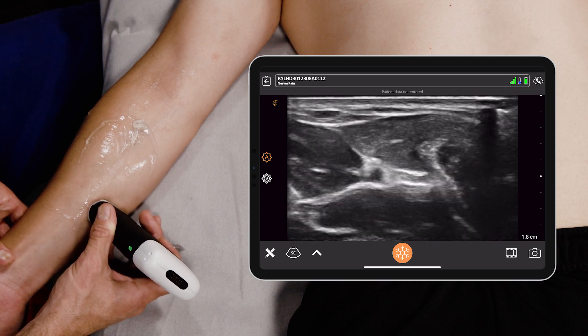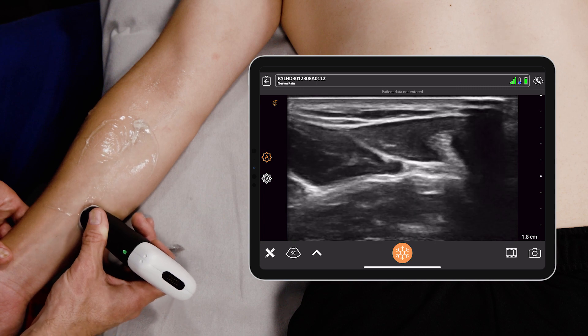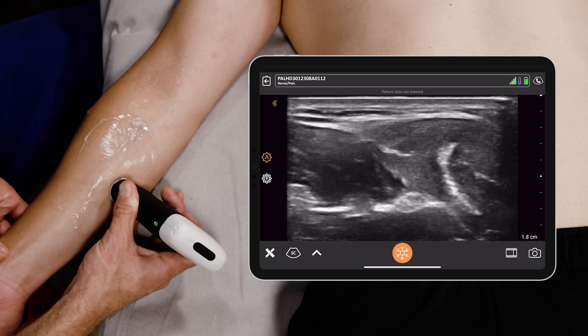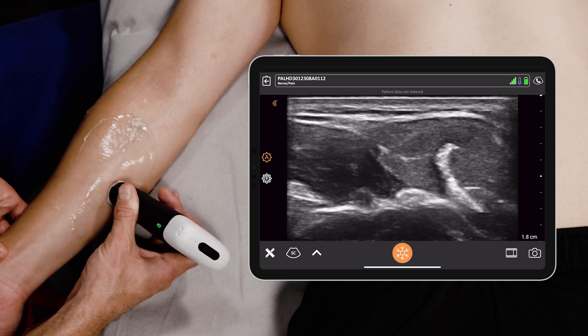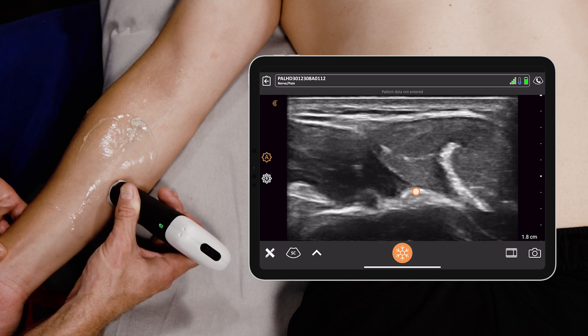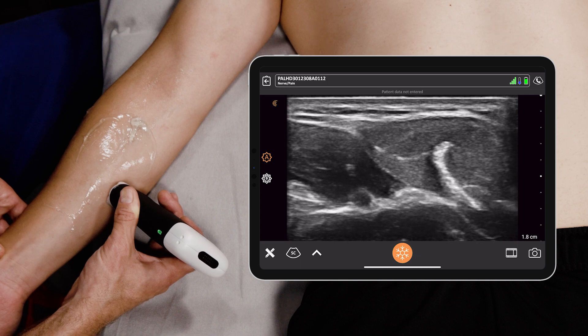What you want to do is march up and down the forearm, looking for a place where the ulnar nerve sort of separates away from that artery, which gives you the safest approach to place a needle. Look right here — in the mid-forearm, we see the ulnar nerve separates from the ulnar artery, and this would be a great place to perform the ulnar nerve block.